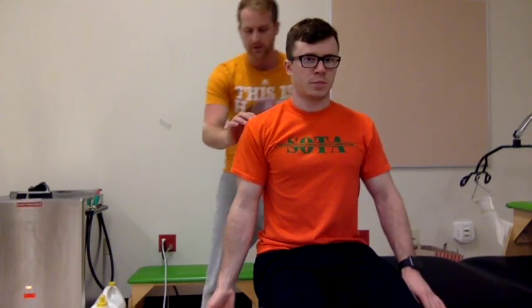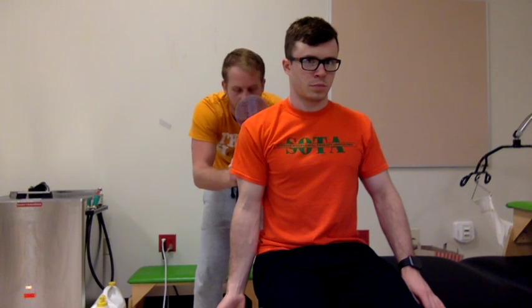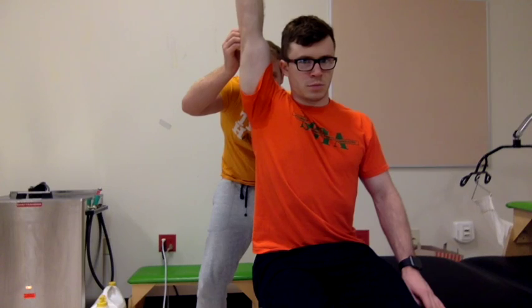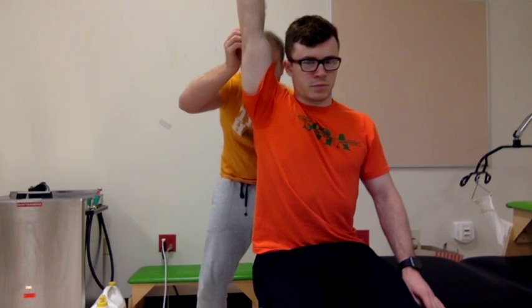We're doing shoulder abduction. You find the acromion process on the posterior aspect of the shoulder, and then both arms are perpendicular to the ground, or parallel to the trunk. All right, go ahead for me. This is going to move just a little bit. And then we got 167 at 5.